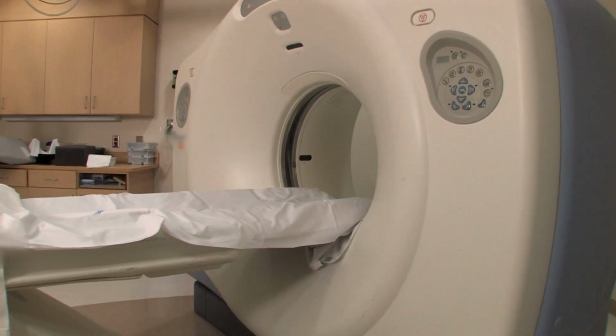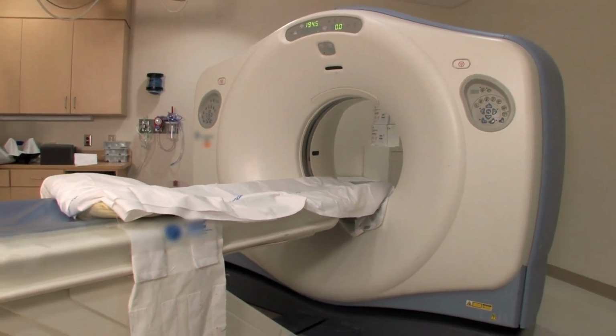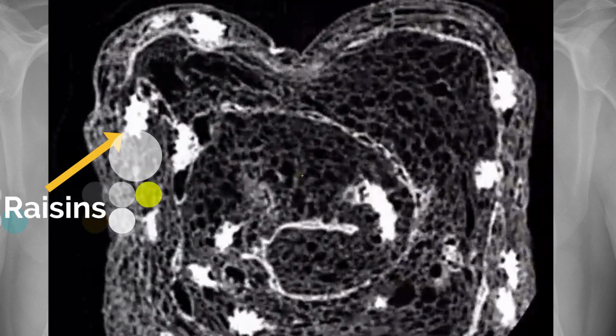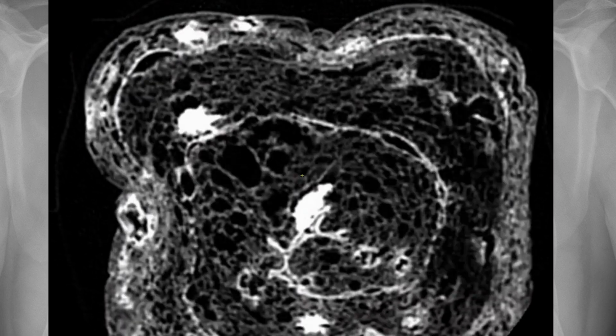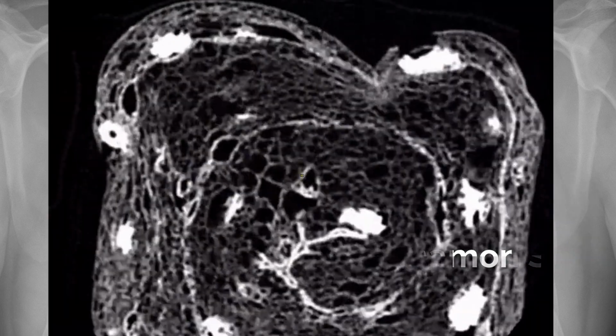And the easy way we'll talk about in just a minute is using a CT scanner. Because, would you believe it or not, you can have a loaf of bread and you can figure out how many raisins are in the loaf, how they're distributed, even without looking inside the loaf at all. You can figure out with a CT scanner how the raisins are distributed within the bread. That's the real power behind computed tomography.